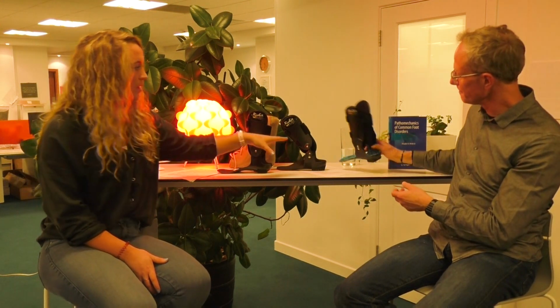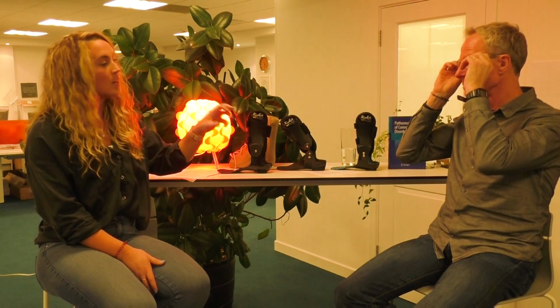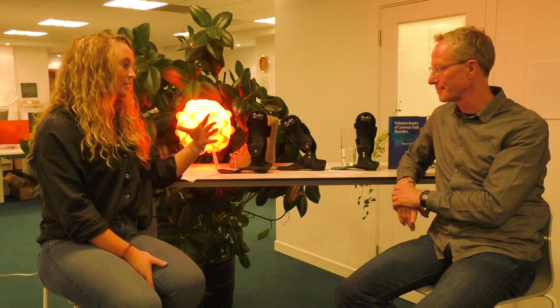And really I think the best advice you gave me, because I know when I was starting out using Richie braces, I wasn't sure whether to go with the fixed or the dynamic assist when it came to foot drop. You explained to me that I have to remember that the dynamic assist wasn't as rigid. So if there was huge foot rotation in other planes, it was probably best to go with something more like the fixed. But then at the same time, if they couldn't get that heel to the ground, again going for something with the fixed, or if they couldn't get it down at all, the Richie Brace wasn't suitable.